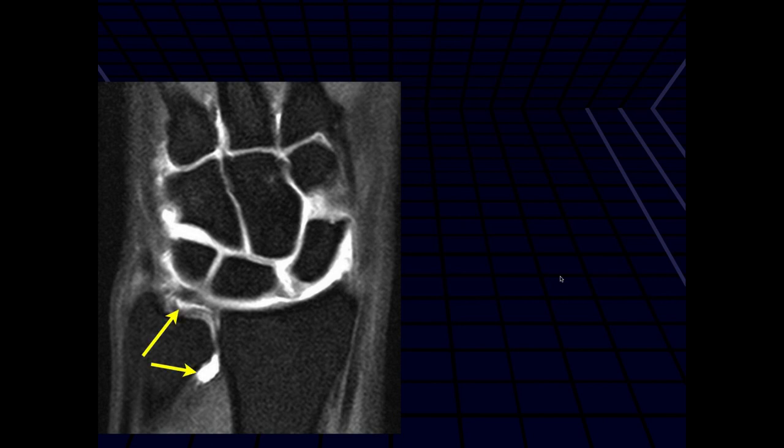We do see fluid right there within the distal radial ulnar joint and we see signal — kind of horizontal signal going through the radial aspect of the TFCC. So it's kind of a weird configuration, like a transverse tear of the radial aspect. And there might also be a tear of the membranous portion of the scapholunate ligament.